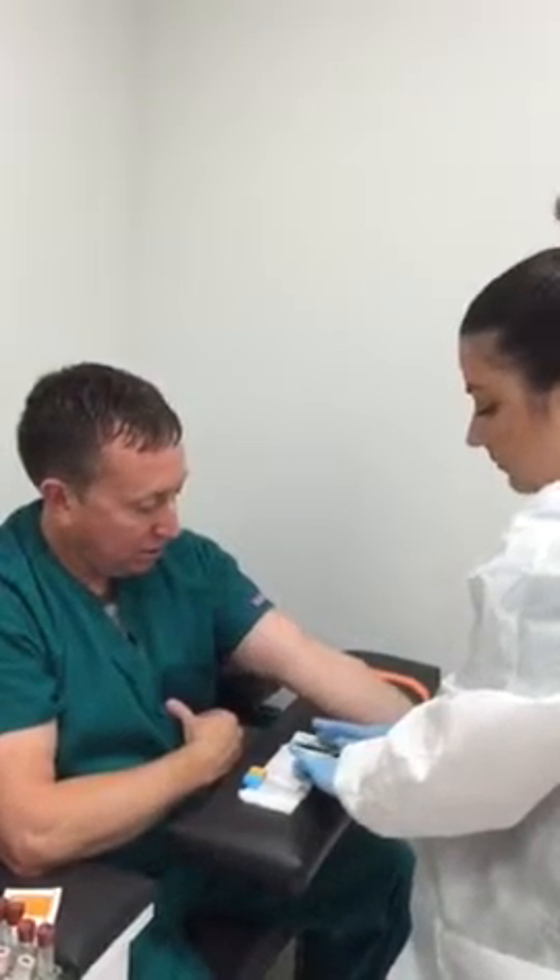While it's drying, the phlebotomist is going to go ahead and get her equipment ready. How long does it have to dry for? At least 30 seconds. Oh, I'm way off.